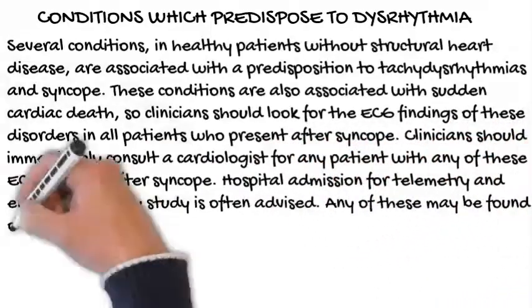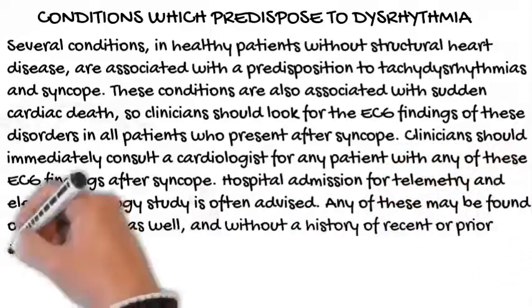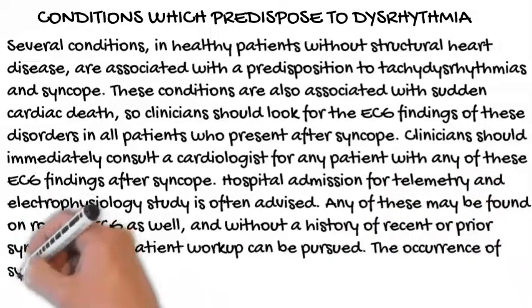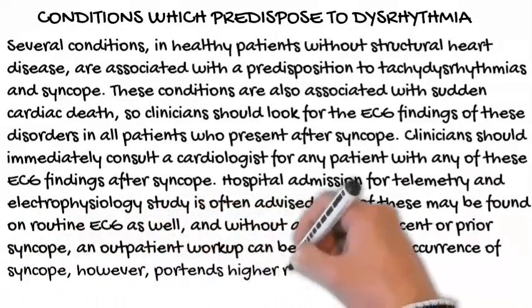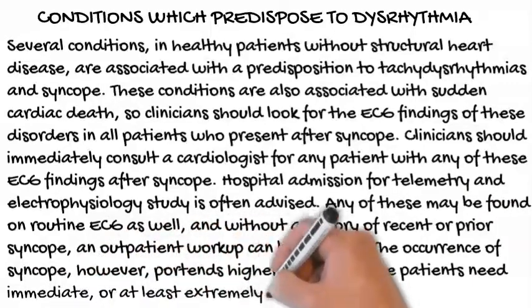Any of these may be found on routine ECG as well, and without a history of recent or prior syncope, an outpatient workup can be pursued. The occurrence of syncope, however, portends higher risk, and these patients need immediate, or at least extremely close, specialty follow-up.